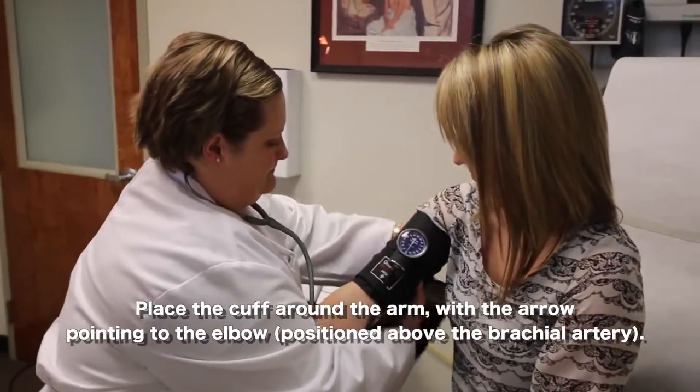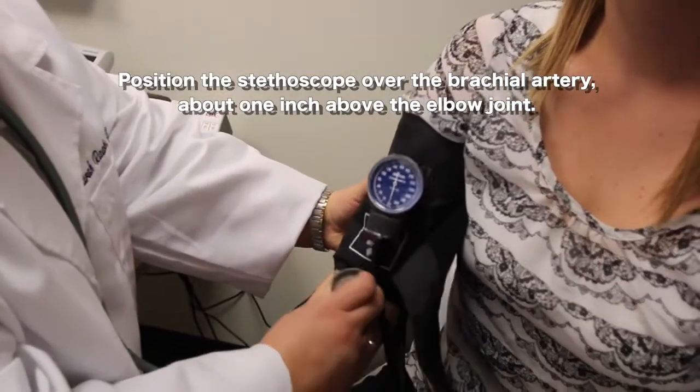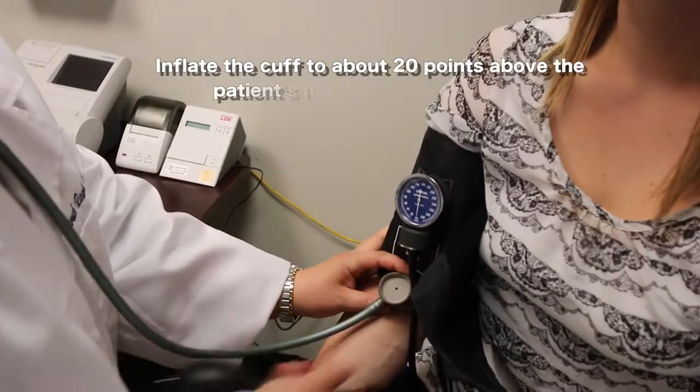Once the cuff is in place, the pharmacist will take their stethoscope and place it over the brachial artery right there at the joint of the elbow. Then they will start to inflate the cuff.